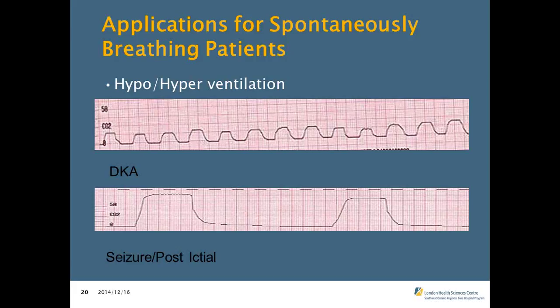So hypoventilation could be caused by, say, an altered mental status, and we discussed an overdose earlier, so that would be one of the causes. A stroke, a tiring CHF patient could be that patient. So they're breathing slower, and we're going to see an increase in their carbon dioxide, and thus those very high readings. So in the case of the bottom one, the number on your screen may be above 58, maybe up to 60. Let's keep in mind that a patient who has a small tidal volume can hypoventilate despite the fact that they have a normal respiratory rate.